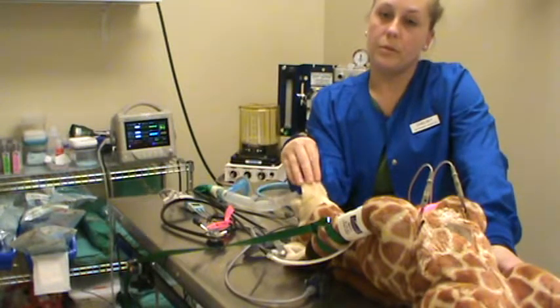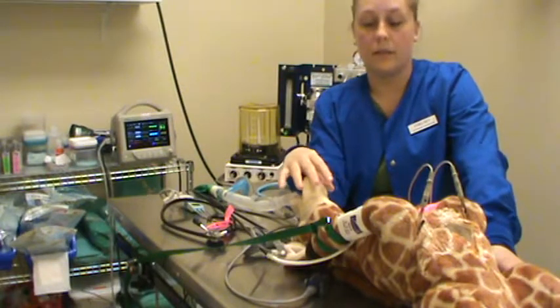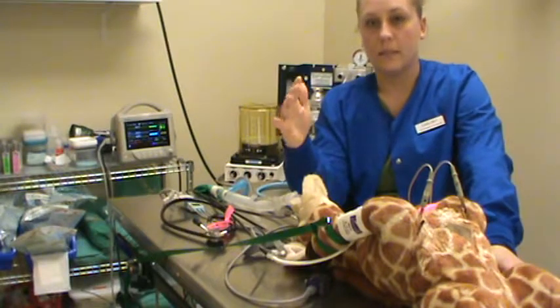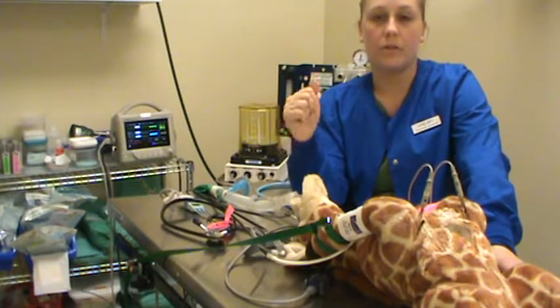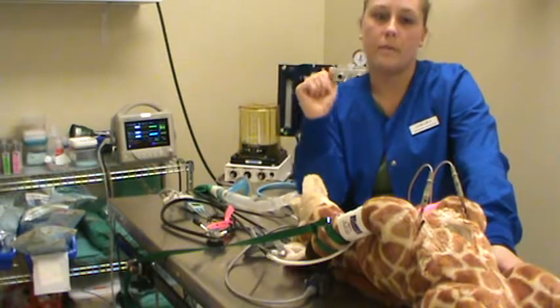So we're going to move on to respiratory rates. So we use a ventilator in here, but if we're not using a ventilator, the patient under anesthesia, cats and dogs are also different. Cat's going to need to be anywhere between 16 to 40 breaths per minute. 40 is going to be fast. So if they're breathing 40 breaths per minute, they're probably a little light, they're probably waking up, you need to turn them up a little bit.